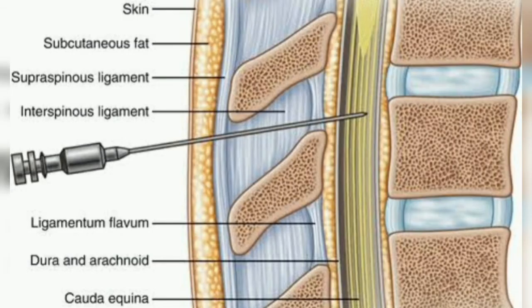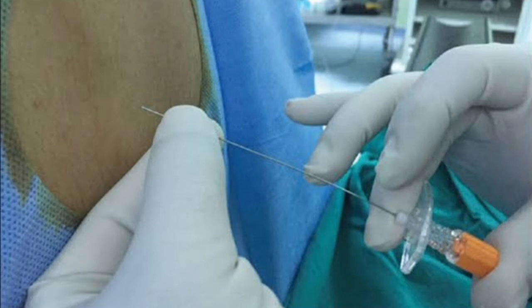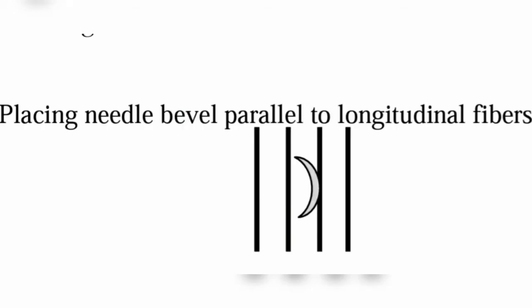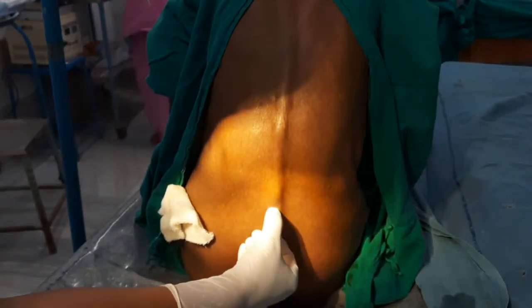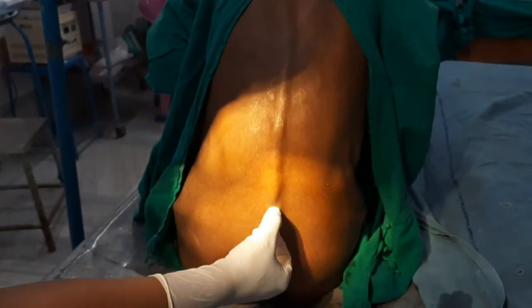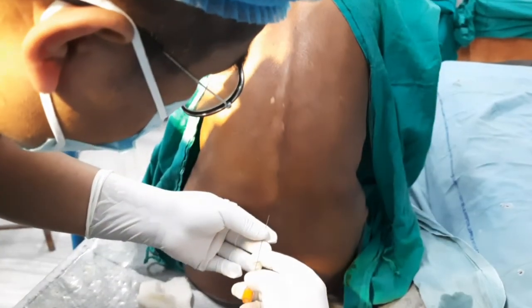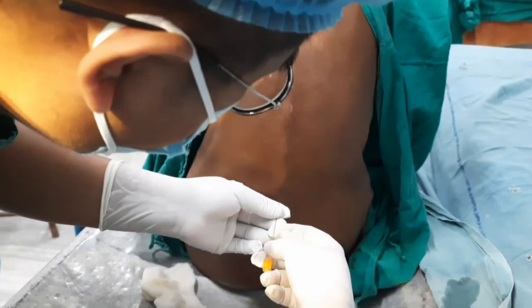The anatomical structures that will be traversed include skin, subcutaneous fat, supraspinous ligament, interspinous ligament, ligamentum flavum, epidural space, and dura mater. Grasp the introducer with one hand and hold the spinal needle like a dart or pencil. The cutting needle should be inserted with the bevel parallel to the longitudinal fibers of the dura — this helps reduce cutting fibers and enhance tactile sensation as anatomical structures are crossed. Control the needle carefully and be prepared for unanticipated movement of the patient. As the ligamentum flavum and dura are traversed, a change in resistance is noted — some will describe this as a pop; however, it may be a decrease in pressure or a loss of resistance.